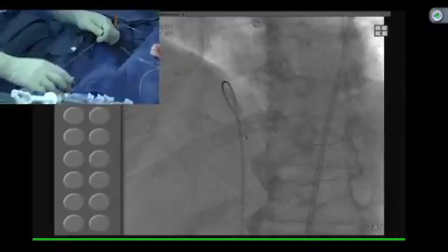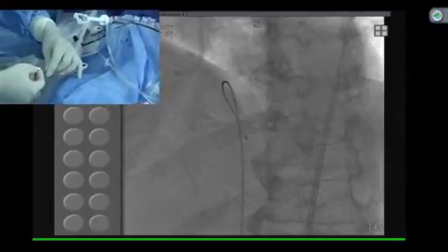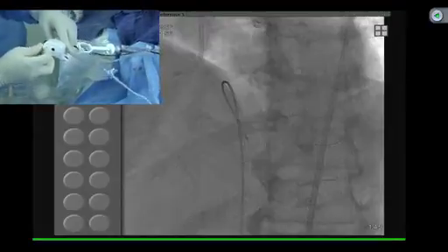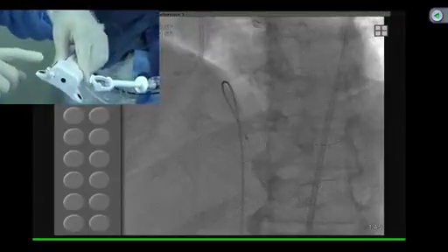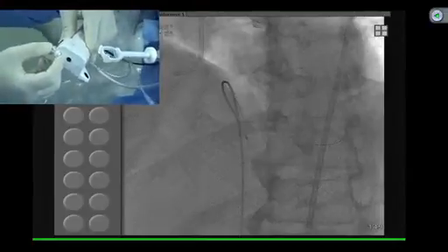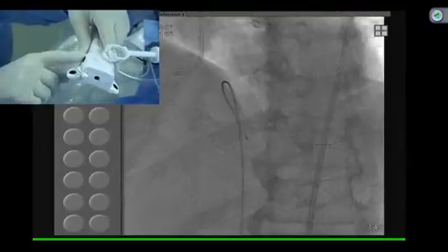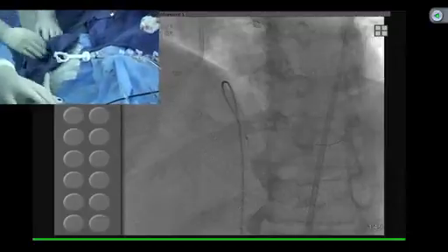And if it is a single person doing it, there is also a system, because not everywhere do you have an assistant. Sharma has an assistant available. So what you do is you can bring this and basically fix it, so then one person can remove it. Now your burr has been stuck. The clip has been inserted and the brake is already pressed. So now you do a one-man procedure. This has actually been advocated also.